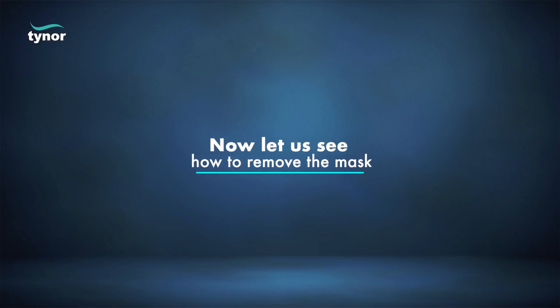straps hanging down. Position the mask on the chin with the top edge up, then pull the side straps over your ears on either side. Gently push on the rims to achieve a good seal.